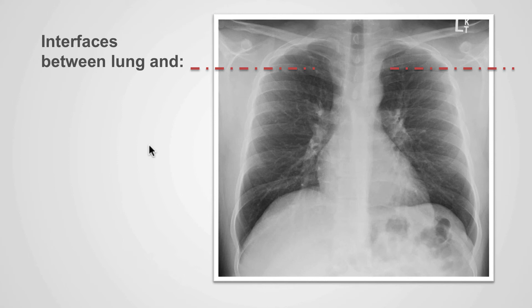So let's now practice identifying the interfaces created between the lung and the other anatomical structures. Along this line, we can identify various interfaces. Can you identify what is causing this border? The answer is the superior vena cava.